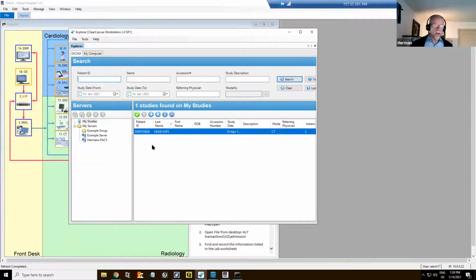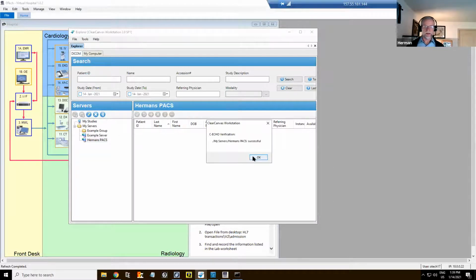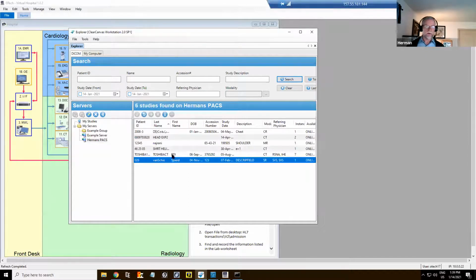Because it's free. So this is Clear Canvas, a workstation, and here is Herman's PACS. I selected the PACS. So this is the search, and I'm doing a search. No, actually, what I'm going to do first is again a verification. Remember, we just want to make sure everything is okay. So do verification. It's right here. Echo success. Okay, cool. And now do a search. So I click on search. It says, are you really sure that you want to do that? Because it might take a long time. Say sure. And I get 1, 2, 3, 4, 5, 6 responses.